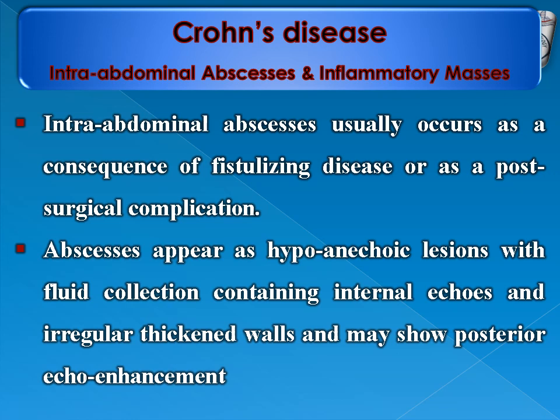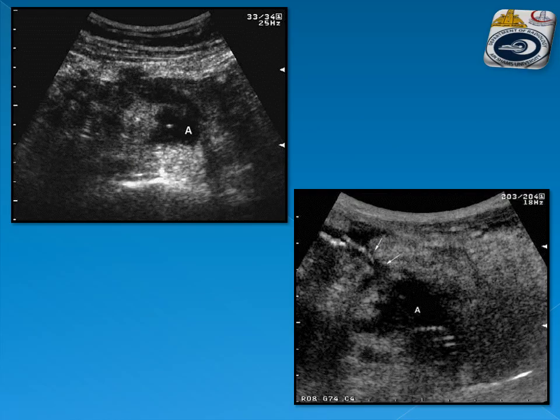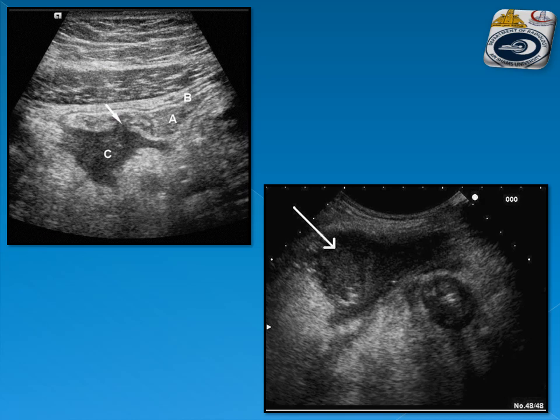Intra-abdominal abscesses and inflammatory masses usually appear as a consequence of fistulizing disease or post-surgical complications. Abscesses appear as hypo- to anechoic lesions with fluid collection containing internal echoes, irregular thickened wall, and may show posterior acoustic enhancement. Examples show abscess collections resulting from fistulae, sinuses causing fluid collection, and abscess fluid collections with thickened walls and variable internal echogenicity.